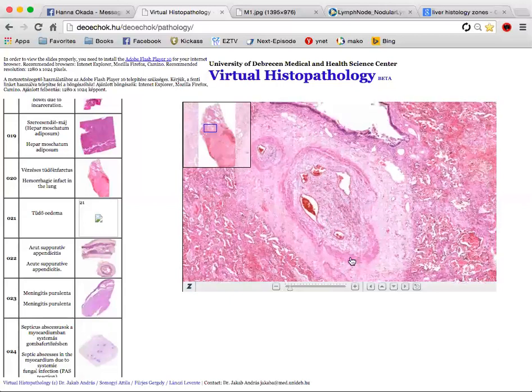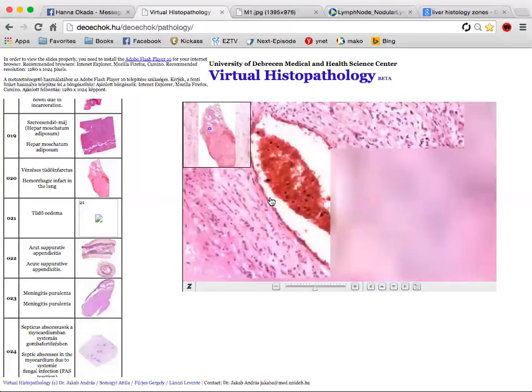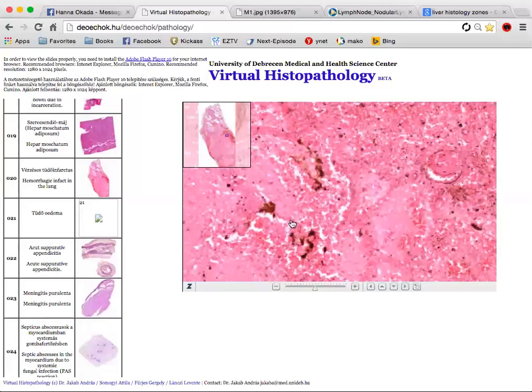Inside the recanalization area, we can see the dark red thing. This is thrombi. This is blood. Okay, blood, they try to go through. Yeah, this is blood. All right, and the area with the necrosis is here.